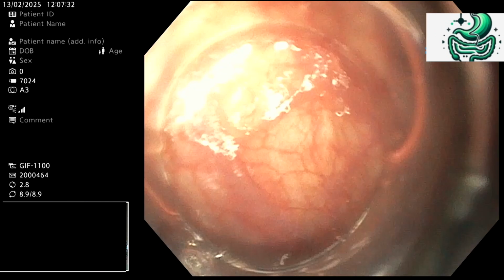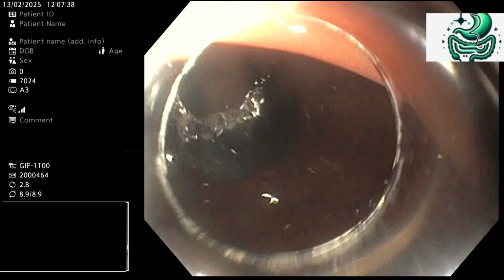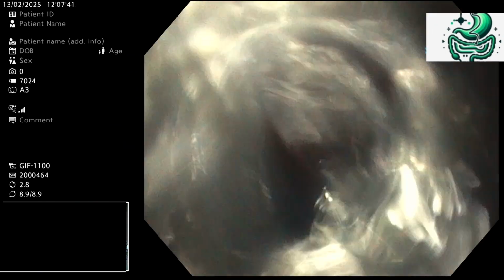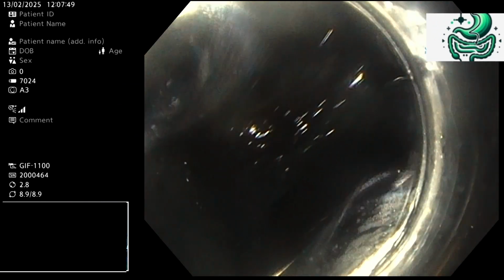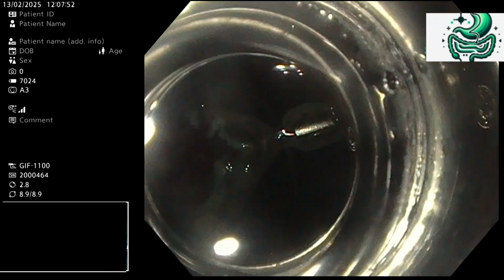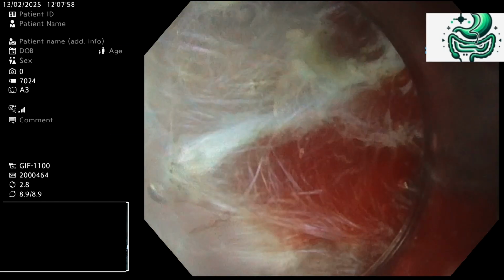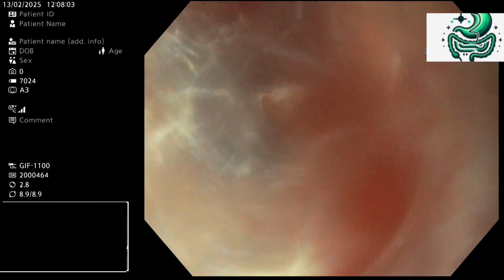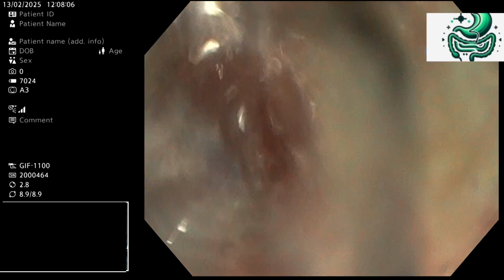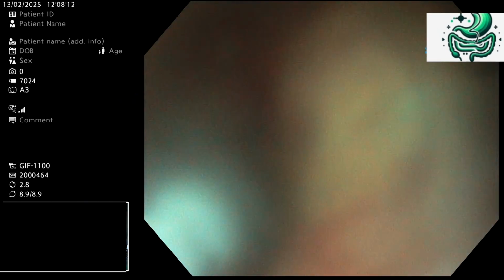We opened the cecal side as we planned, and then we opened the oral side, and we had some problem opening the submucosal space here, so we did a traction. I'm not sure if you can see the traction here now. After the traction, we have a nice view of the dissection plane. We have just a small part to connect this oral side to the cecal side we already opened, and we have some oozing vessels here. I still believe we can do it with a knife.